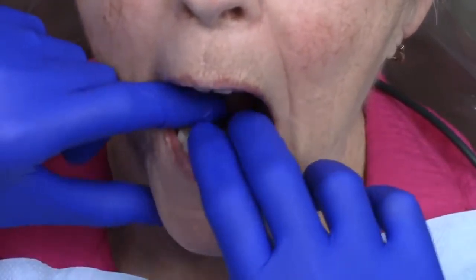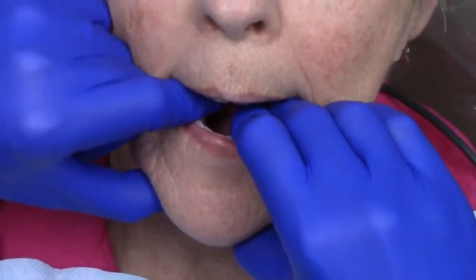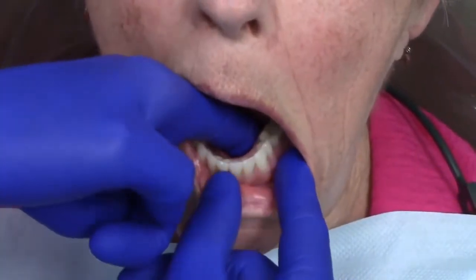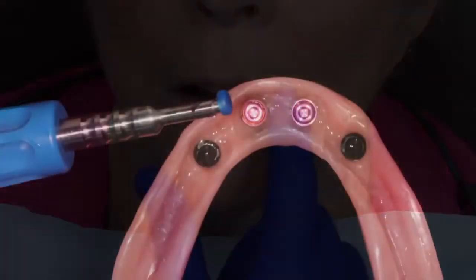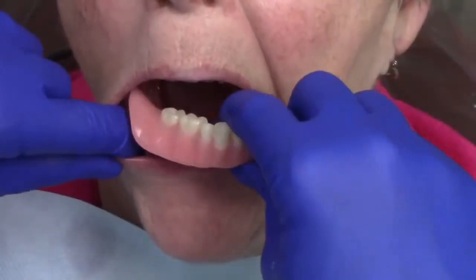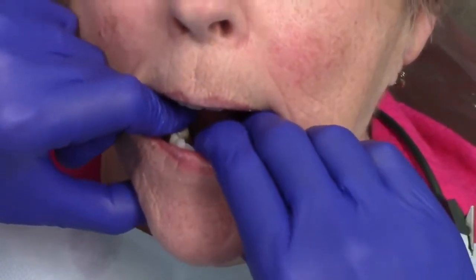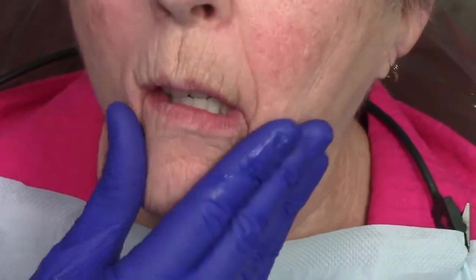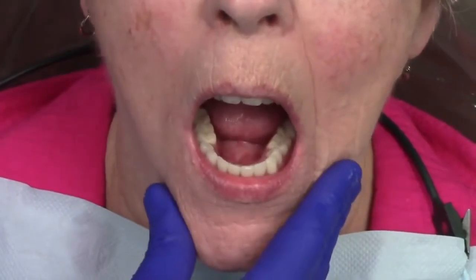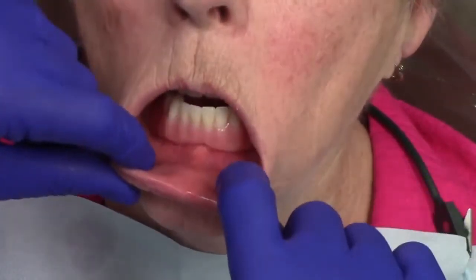After using the trim and grind burrs and cleaning up the denture, I seat it back onto the edentulous ridge prior to any fine polishing adjustments. This allows me to verify the pickup procedure before fine polishing and tuning. Now that I've confirmed the attachments have been picked up properly, I change the Locator RTX black processing males to the blue inserts. I place the denture back in the mouth and confirm the patient is comfortable with the retention and stability of her prosthesis, testing retention and stability using fingers in a back-and-forth motion as well as patient up-and-down movement.